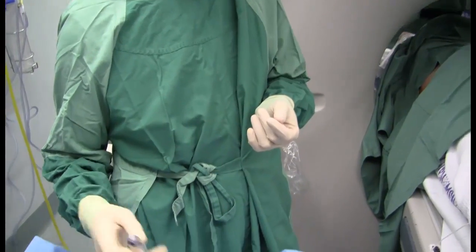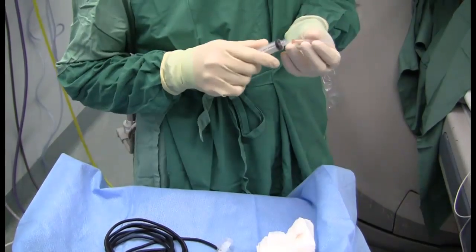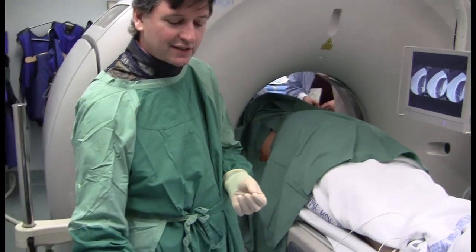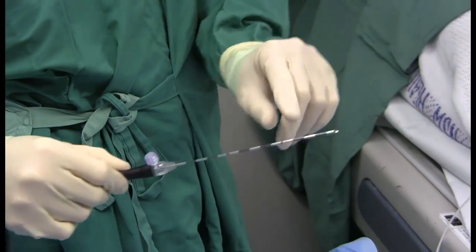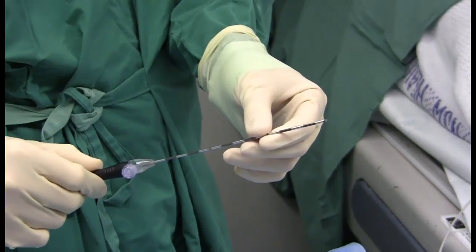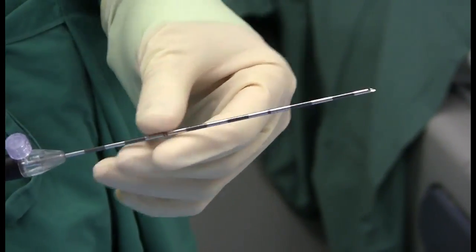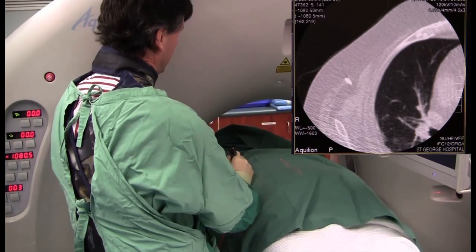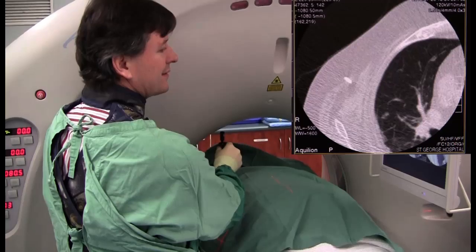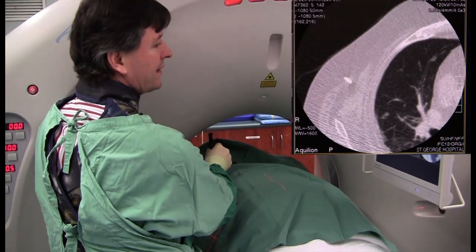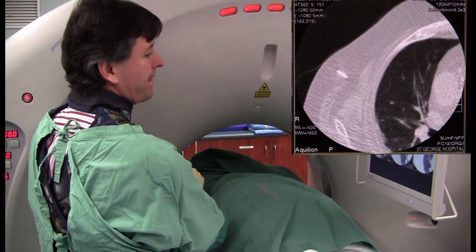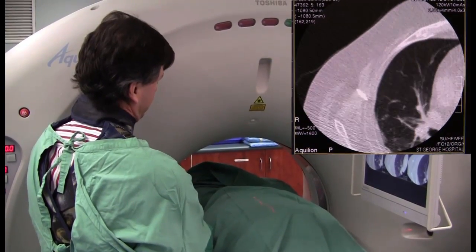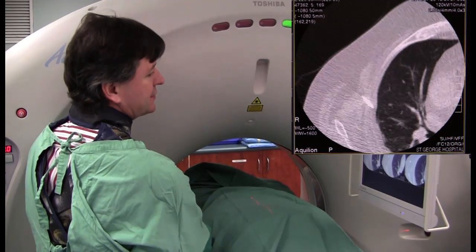Even though we have general anaesthesia, we reduce the inhalation requirements by using local anaesthetic. As an interventional radiologist I always feel nervous sticking needles without any local anaesthetic, so we're going to draw up some lignocaine 1%. We're going to flush the system with saline and then park the needle. The Rita needle has a little bevel on the end — it works like a Chiba needle, so there's a certain amount of steer with that bevel, which we use to negotiate underneath ribs. The side of the bevel is marked by a little port. We're just placing the needle in now, watching on screen.